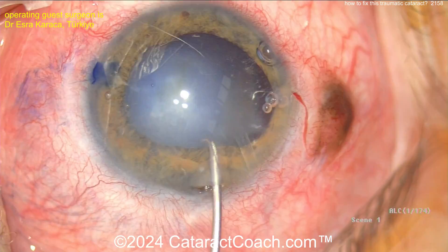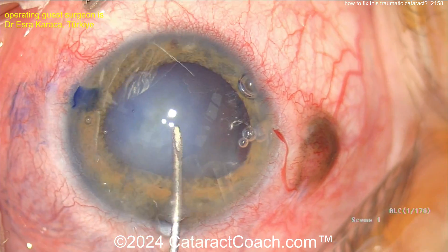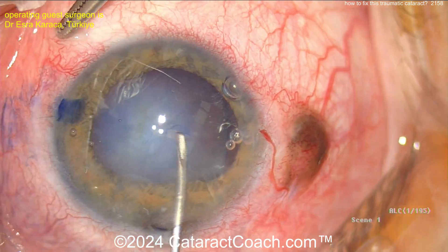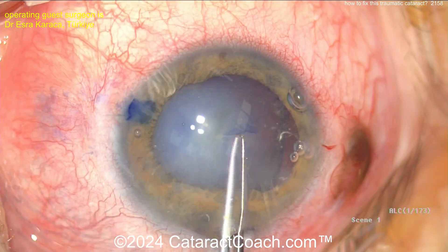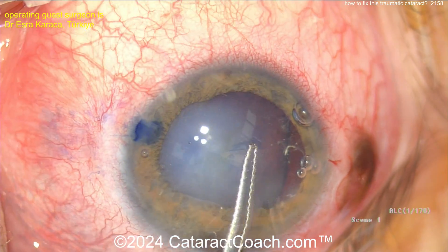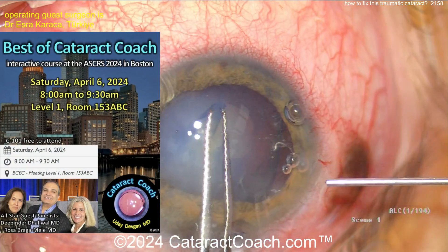Here's the main incision being made. And now the rhexis. It looks like there's reasonable capsular support to get the rhexis — it's got a little bit of wrinkling of the capsule. That's okay. Now remember, keep this rhexis intact, round, and centered.